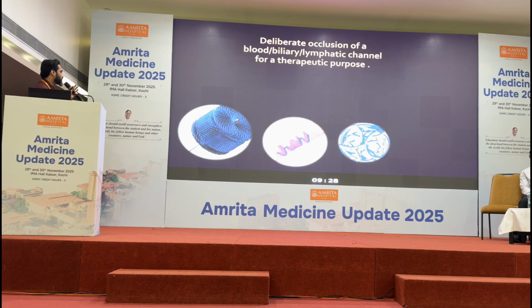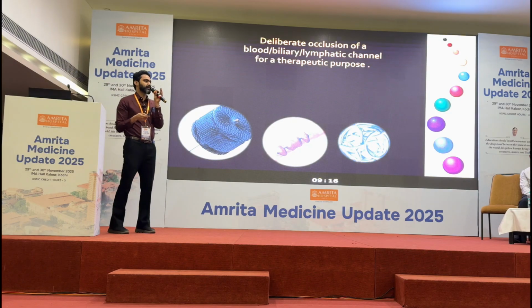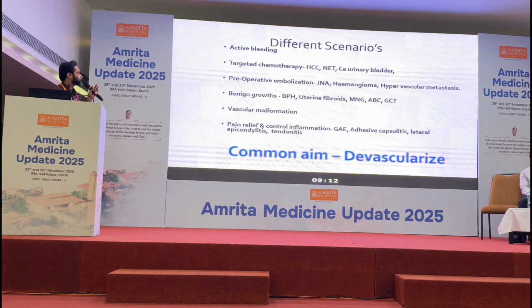In solids, the one on the left hand side is a plug, the one on the right hand side is a coil, and on the extreme right are PVA particles. There are different kinds of particles, polyvinyl alcohol particles, embospheres, etc., which we use for embolization.